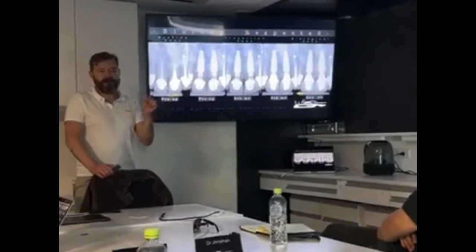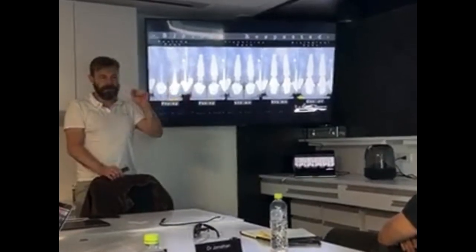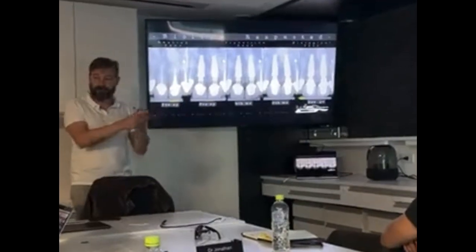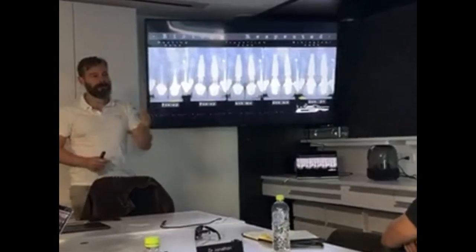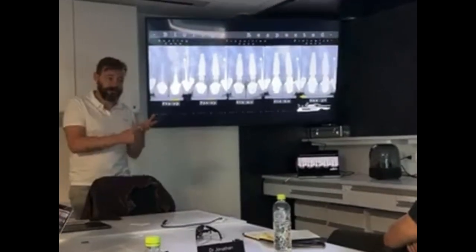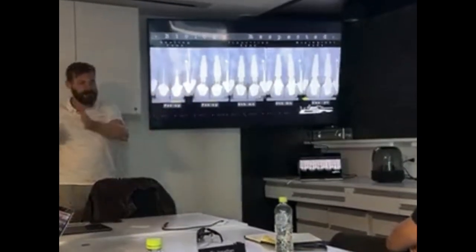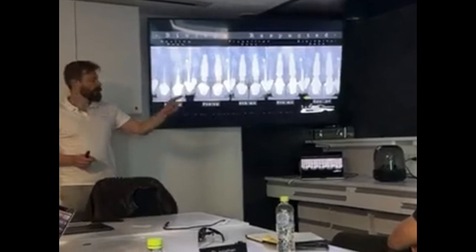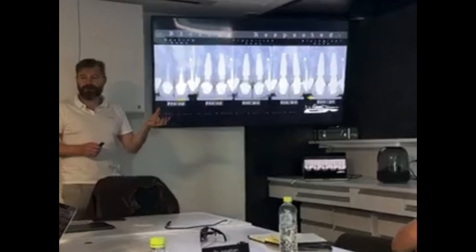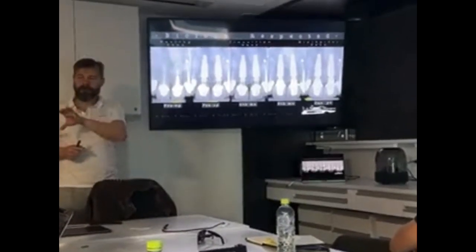But not all the times you're going to have the chance to get the perfect socket to preserve it. And then you're going to start to talk about some deficient sites that I need to fix the phenotype, talk about the thickness. We're going to fix some recession, some soft tissue dehiscence, and some bone dehiscence on the immediate implant placement. Okay, so we're going to still finish this view, how to preserve the tissue, and then after the sequence we're going to try to rebuild on the immediate implant placement.